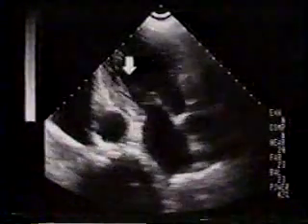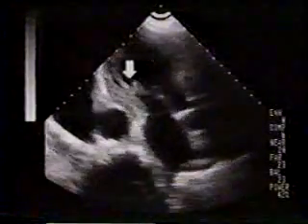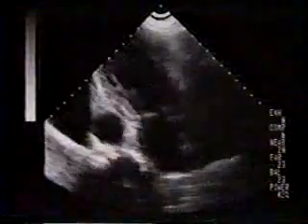This is a view of the partially ruptured posteromedial papillary muscle from the apex. The descending aorta and left pleural effusion are also evident. The patient underwent successful mitral valve replacement.